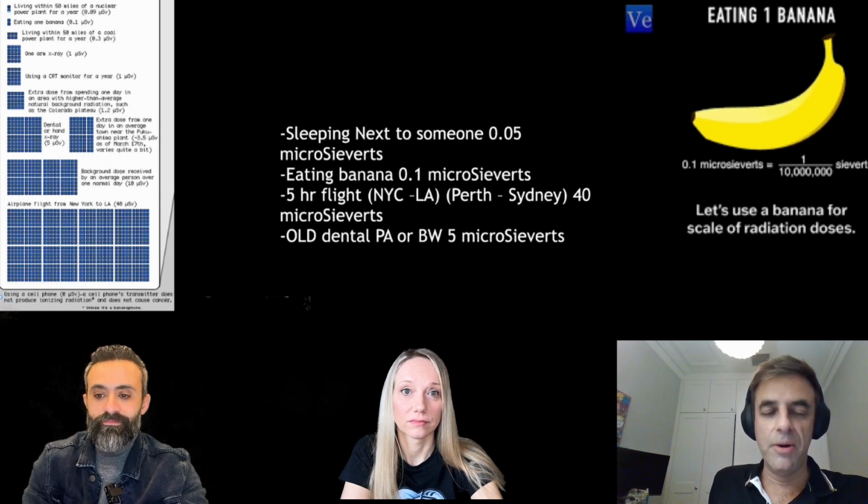In fact, I did have a look up online before this talk, and a 1 sievert dose is a very high level, and that's considered to be a serious level of radiation in one dose, which would be equivalent to 1 million microsieverts. So again, it's a bit like if we look at radiation as a toxin, and if you have a very, very, very, very small amount of that, but you have it infrequently, it's completely fine.